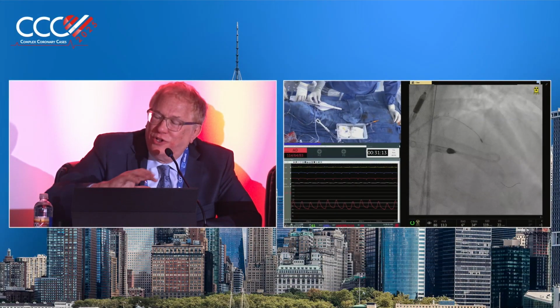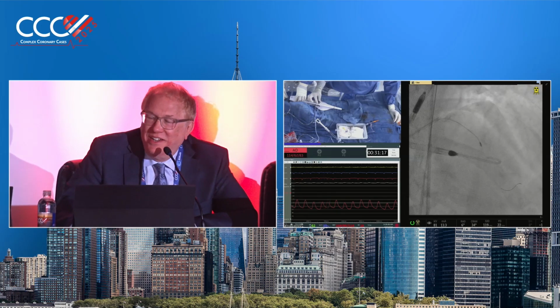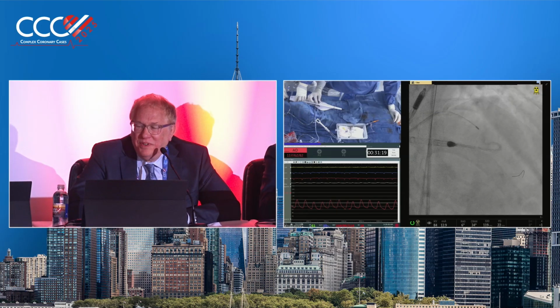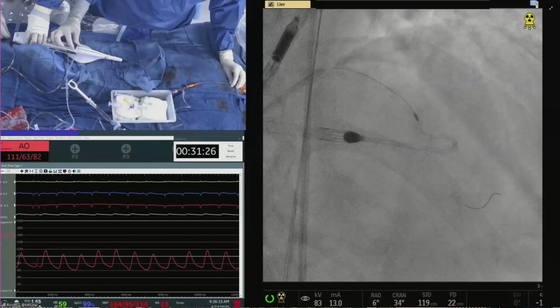I think this right vessel now looks so small and diffusely diseased, but we know the LAD is a lot bigger than this. I'm sure she's planning on doing that. I know she has the entire imaging team here, right? I think we don't need to go there.